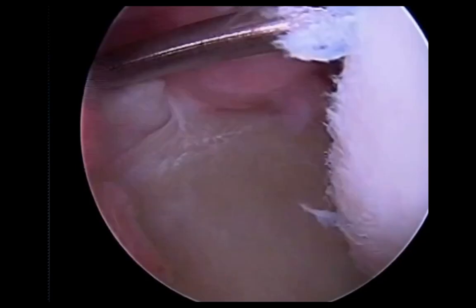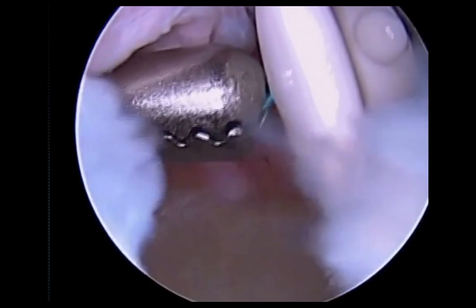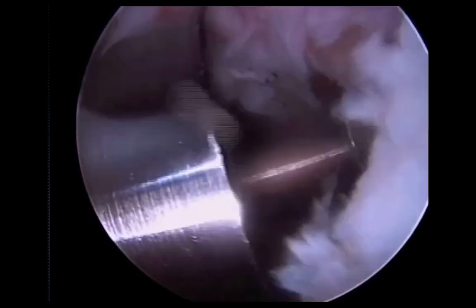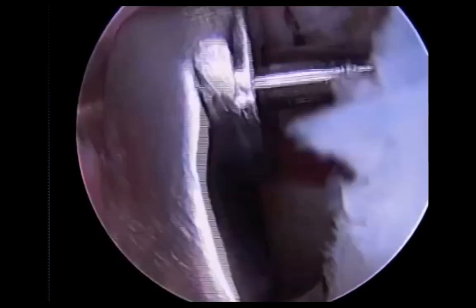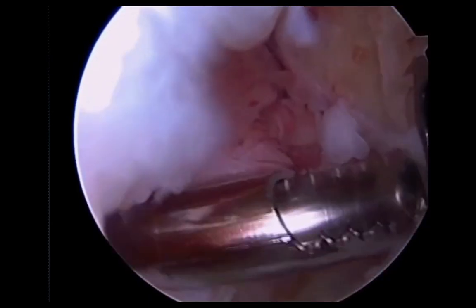We insert our screw. We trial to see that we are at the appropriate depth with a slight recess. We score the edges of articular margins. The router is very carefully introduced so it does not destroy the posterior capsule and rotator cuff. A retractor can be inserted through an anterior portal to push the rotator cuff out of the way. Any excess debris is then removed.